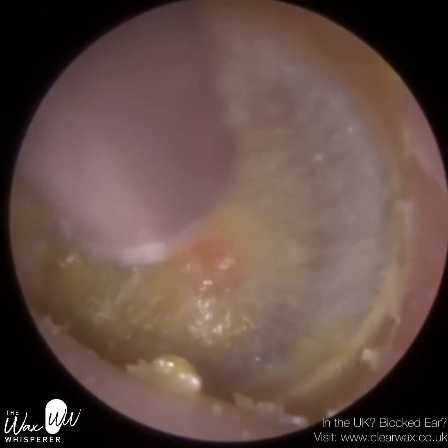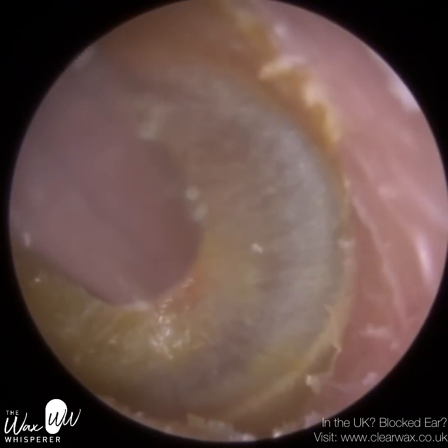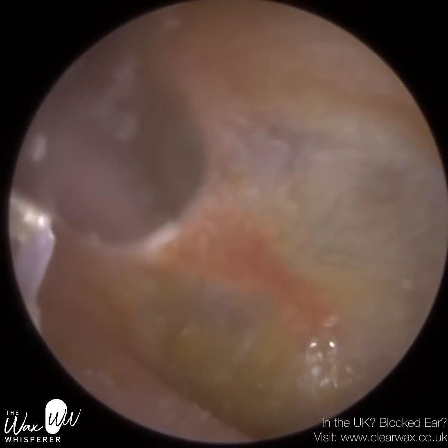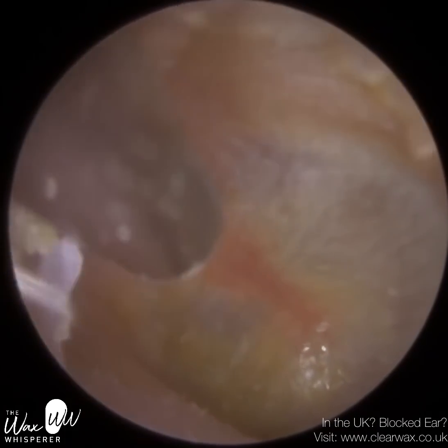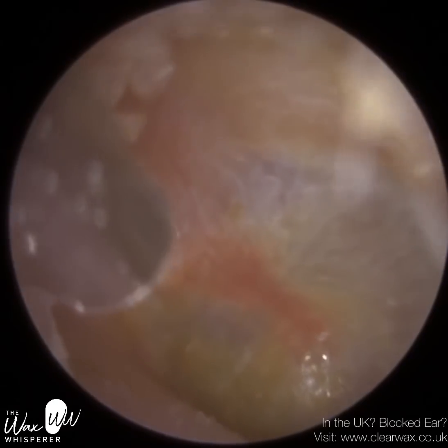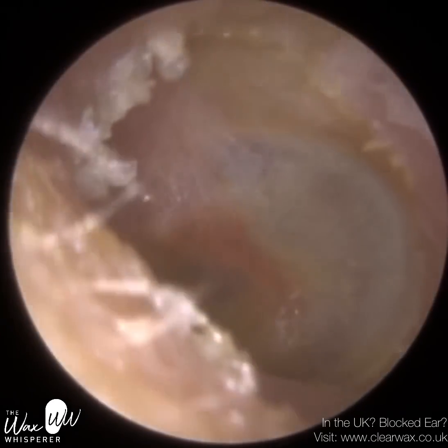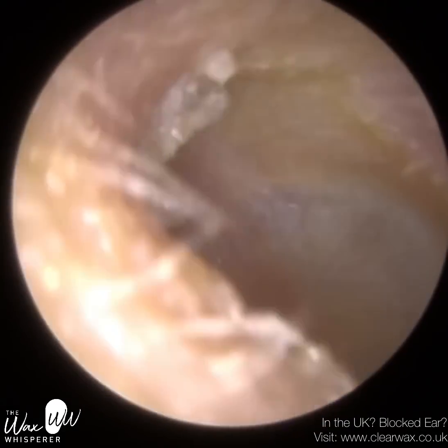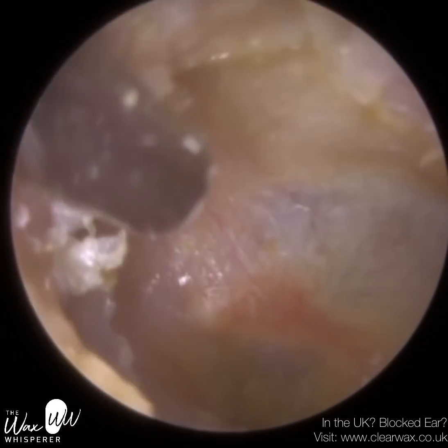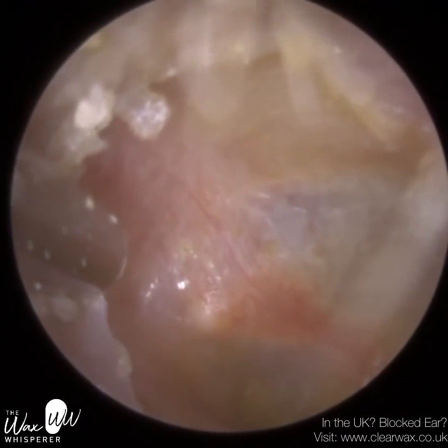I just explained to the delegate not to worry. They've done the right thing, and just to get the patient to use some drops to further soften it for them. Now, I don't generally ask my patients to use drops. If I need to use drops myself, as you know, I use them during the procedure. And I'm trying out a new olive oil spray at the moment, which is really exciting. They're made by a pharmaceutical company not far from me, and we're giving some advice and tips and working with them at the moment. So it's quite exciting when you've got new products and you can try them.